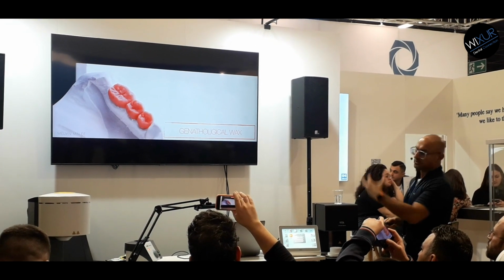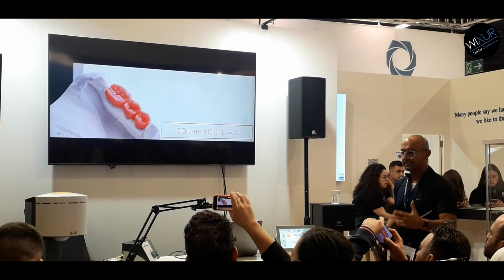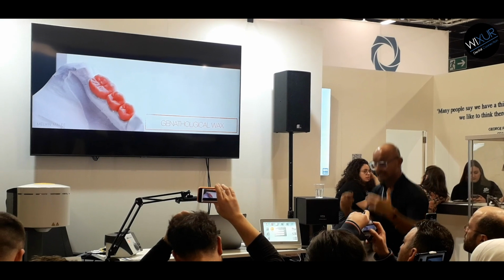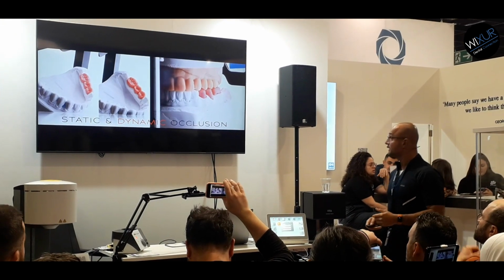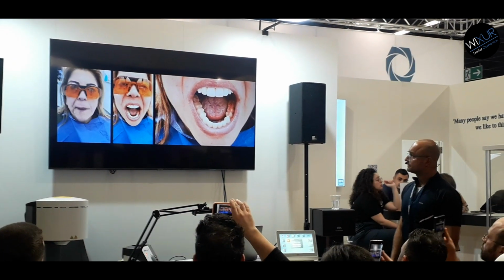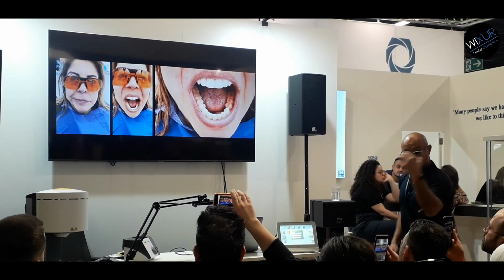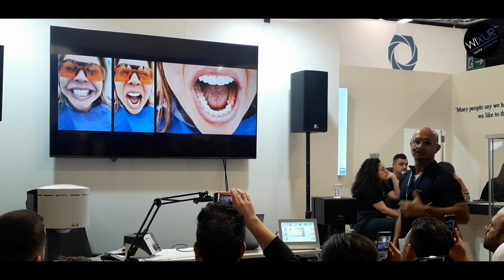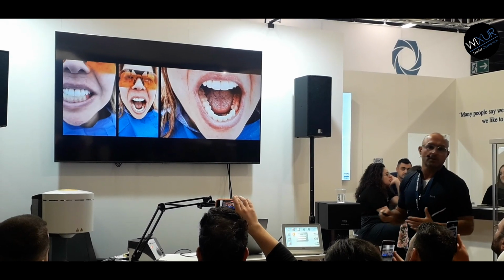This is wax which goes to the mouth, and by body temperature becomes softer. And the patient can chew on it in the natural head position. So the patient comes to the office, the dentist puts everything in the mouth, the patient sits down and starts chewing on it. And we give also some chewing gum to the patient. It looked like that. So, don't be careful, just go ahead and create the customized occlusion pattern. That is the best way, there is no other way.